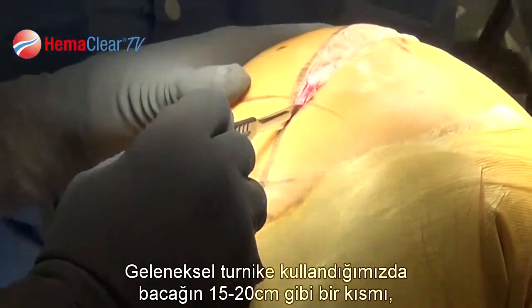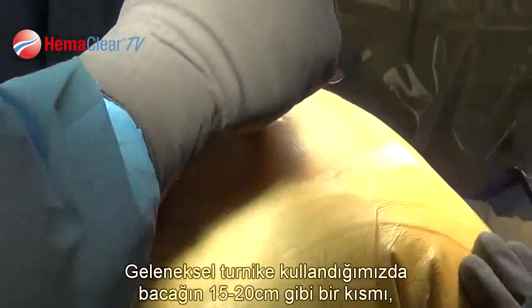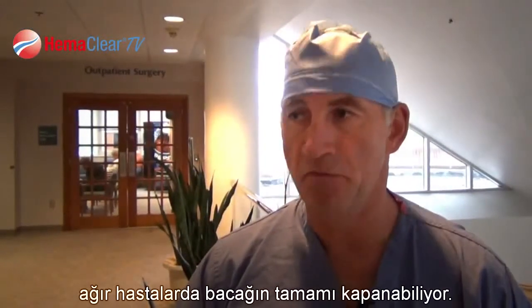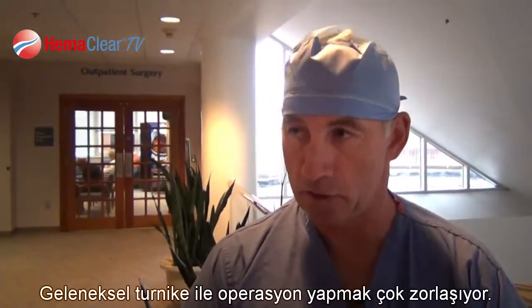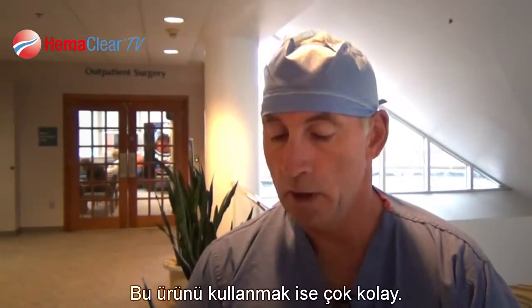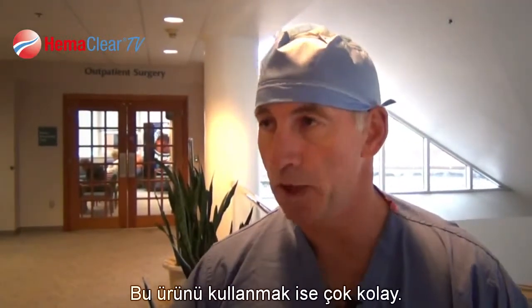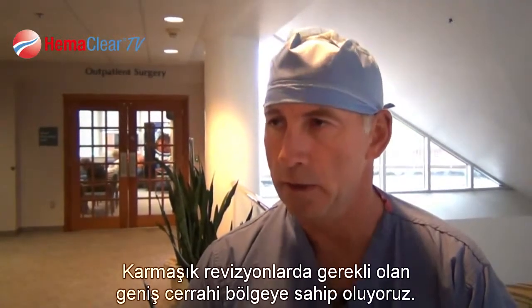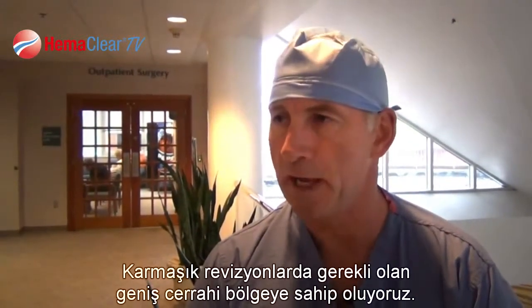When we use a traditional cuff, you lose about six or seven inches of leg, and if it's a heavy patient, maybe even a foot of leg, trying to get a traditional tourniquet on there. It's actually much easier to use this because we just apply the standard drapes and then apply the HemaClear, and we have more than adequate surgical field, even for complicated revisions.